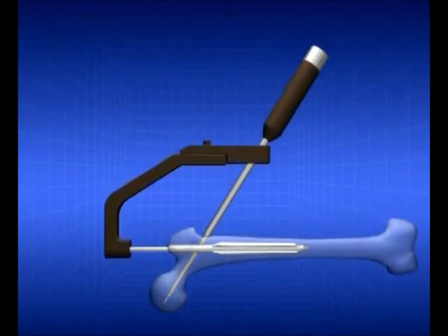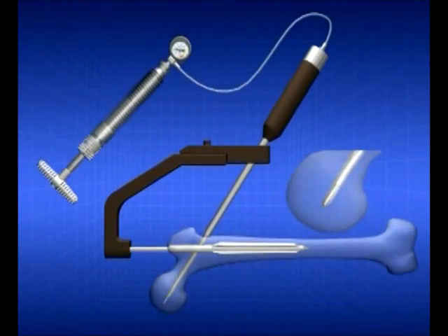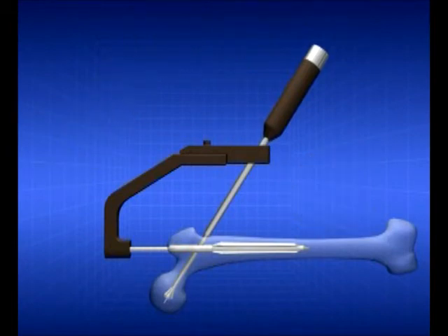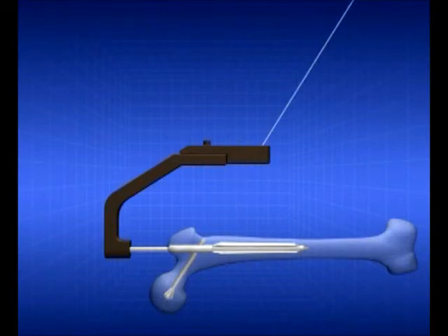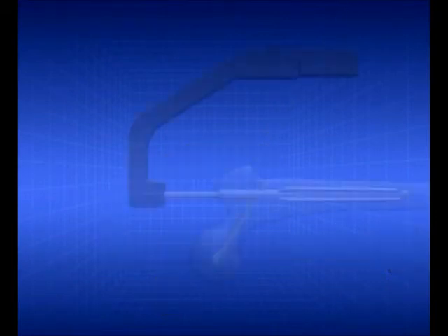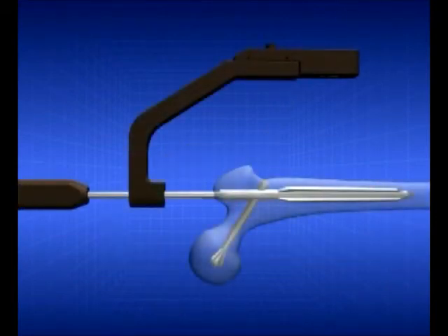The same pump is connected now to the peg insertion handle. The peg distal part is inflated within the femoral head. The peg dynamization can be limited using a dedicated screwdriver which is inserted through the nail proximal end.